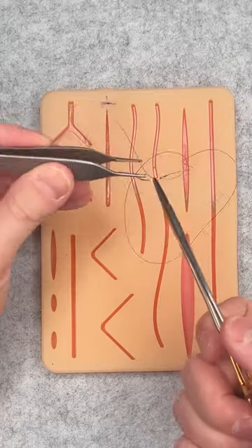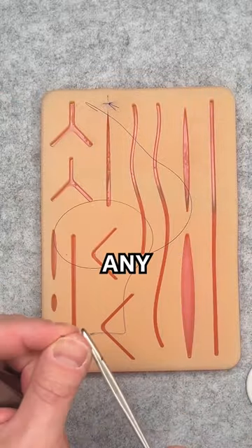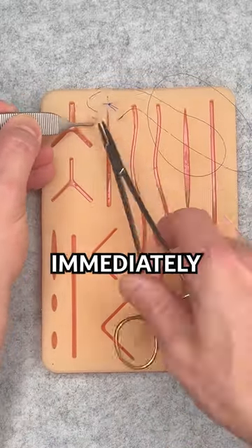Then you take your bites. You want to progress as evenly as possible — any variation will be immediately obvious.